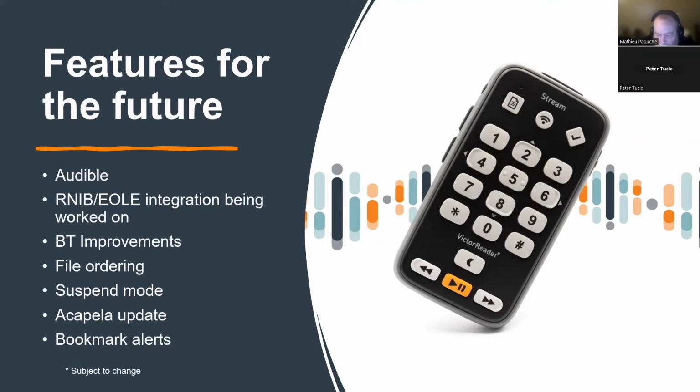We've heard complaints from people saying that this new Stream takes too long to boot, and it is a different architecture. It's a different operating system. By its nature, it takes a bit longer to boot, just like my very first iPhone took a lot less time to boot than my new Google Pixel 7 phone. As time goes by, sometimes these things lengthen, but we want to offer customers a solution to shorten it: you'll be able to put it to sleep.